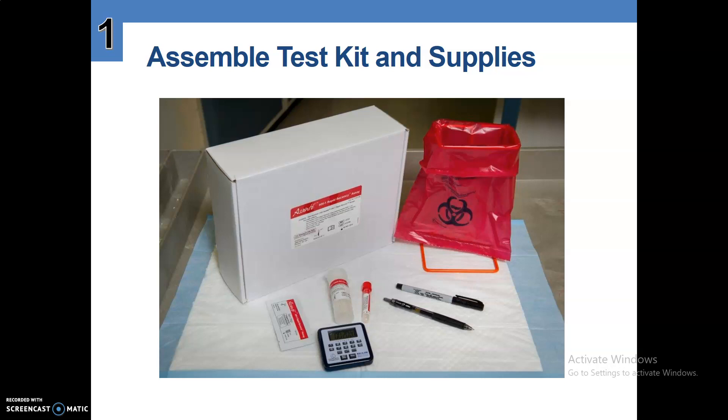Number one, assemble test kit and supplies is shown in the picture — whether it's the Asante box kit, the biohazard bag, a pen, a marker, a preset timer, and the kit components which are the test strip, the loops, and the buffer.